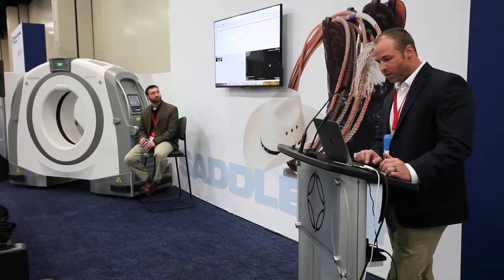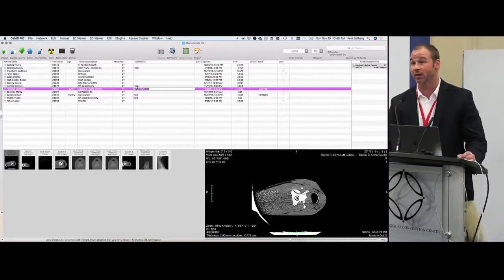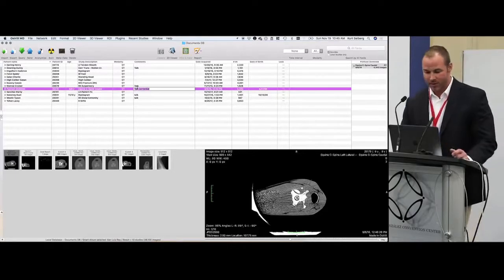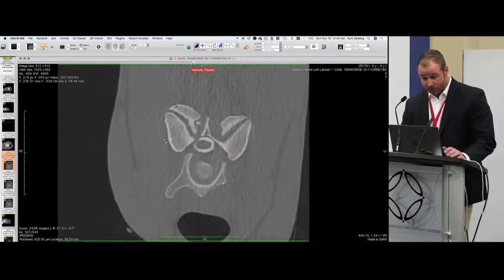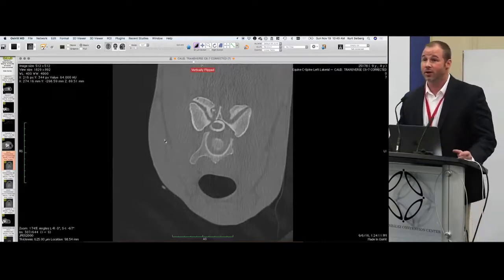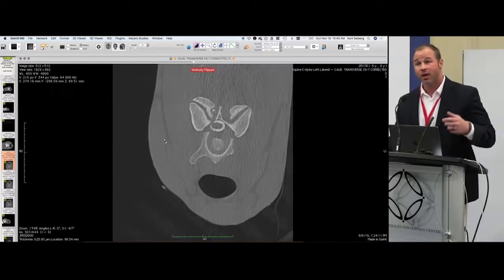I want to start with ultimately kind of the sexy portion of this, which is the caudal aspect of the neck. And what we're finding more and more when we look at these necks, specifically in doing myelograms, is that our standard myelograms are potentially underestimating, and we've kind of surmised this has been happening for quite a number of years, underestimating what is actually compressive and what is actually compressing the spinal cord.